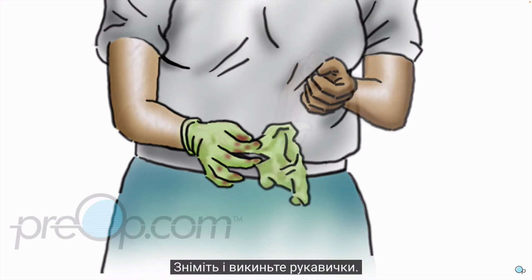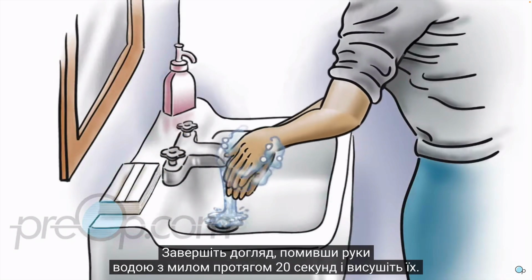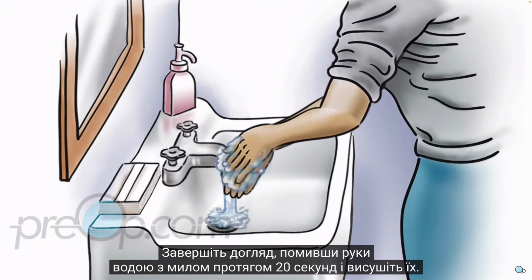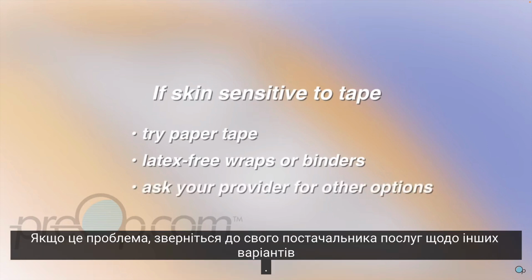Take off and throw away your gloves. Finish care by washing your hands with soap and water for 20 seconds and dry them. If your skin is sensitive to tape, try paper tape. Latex-free wraps or binders can also be used to hold dressings in place. Ask your care provider for other options if this is a problem.